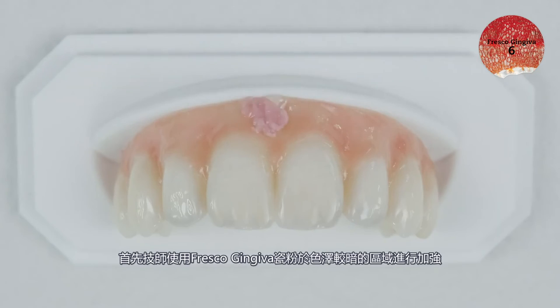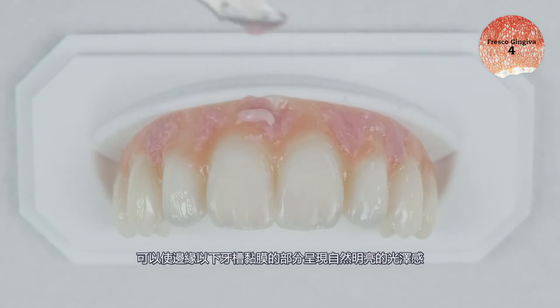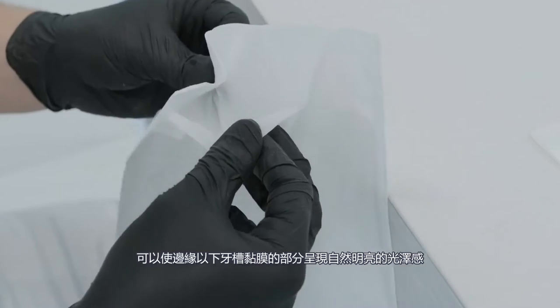First, the darker areas of the gingiva are blended with Fresco Gingiva pastes. Lighter shades are then applied to achieve a natural reproduction of the alveolar mucosa down to the marginal gingiva region.